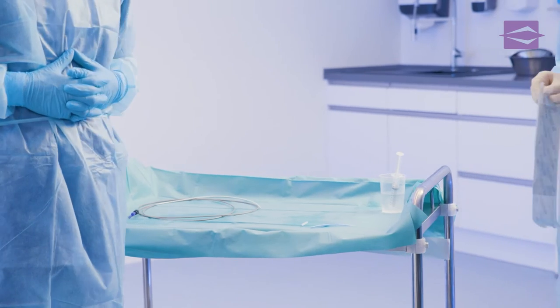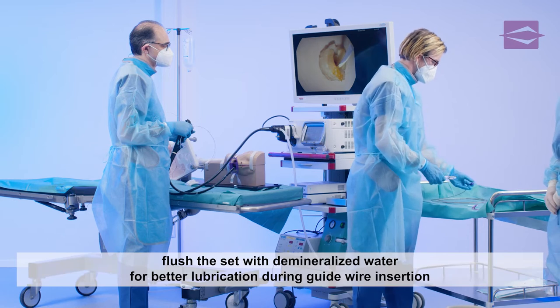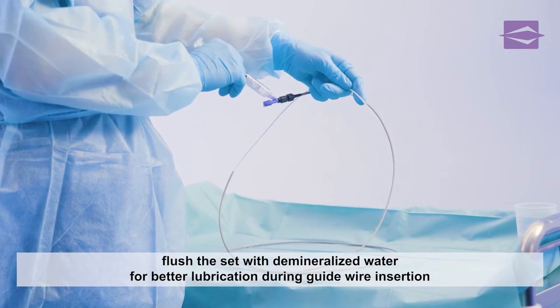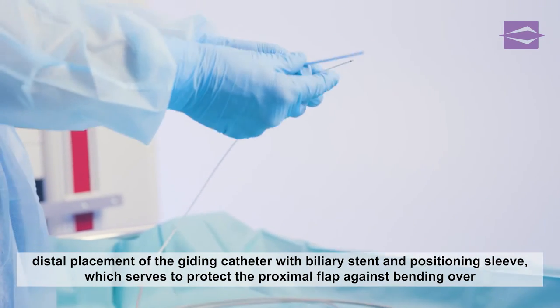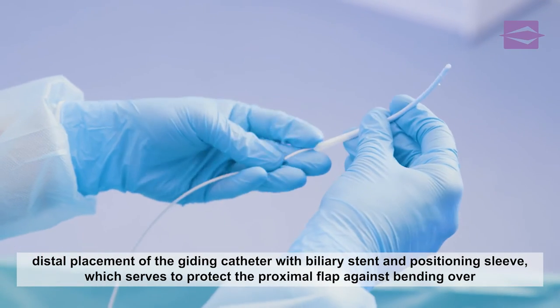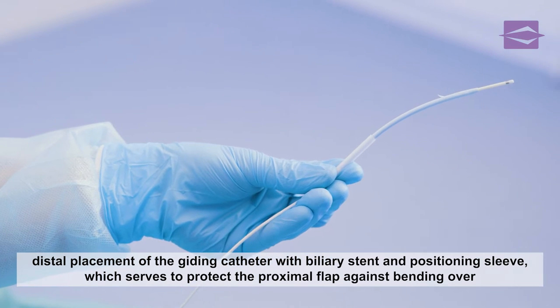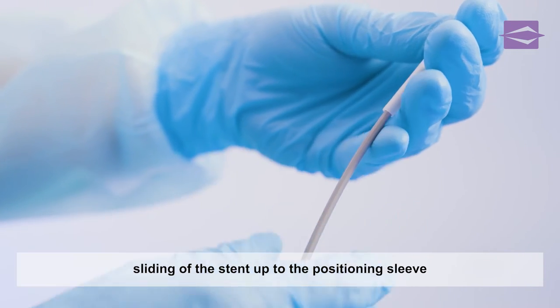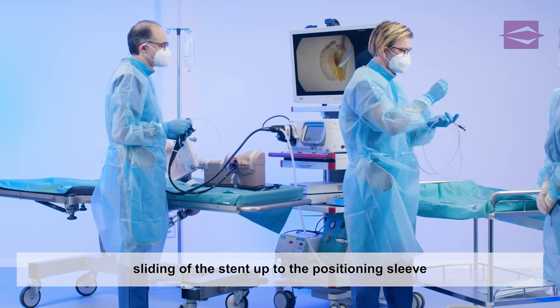To improve the gliding properties of the guide wire, which is already inserted in the duodenoscope, it is recommended to rinse the guiding catheter with demineralized water. Once this is done, the assistant can place the biliary stent in the placement set. To do this, the stent, together with its positioning sleeve, is moved distally over the guiding catheter up to the pusher. The stent positioning sleeve acts as a kink protector of the proximal stent flap during insertion into the duodenoscope.